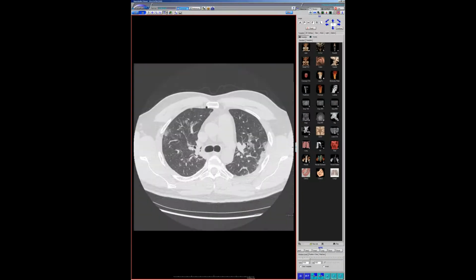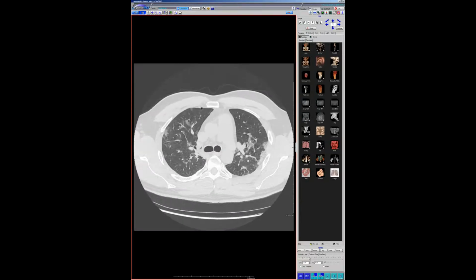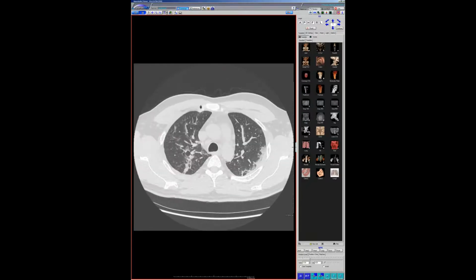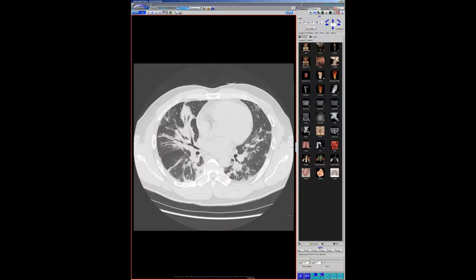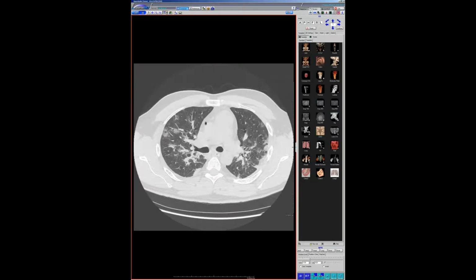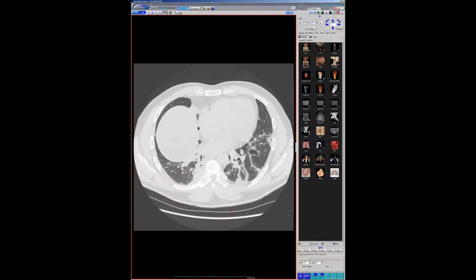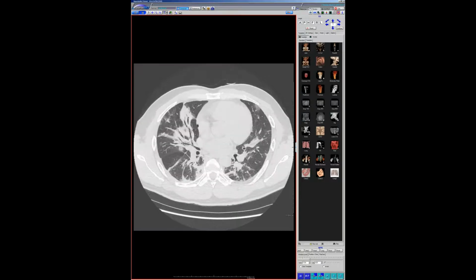And then here's our first case of COVID. So not the most, has some features that are shown in all the different lectures and papers, but has some areas that I would say are not atypical. I think this guy was, you would imagine, sick for a couple days before he actually sought treatment, and he sought treatment because he passed out in an IKEA. He was sick for about a week, decided to go out to IKEA, passed out. Someone called the ambulance. He came into the hospital, had the CT, and then tested positive for the virus, more of that organizing phase of lung injury.